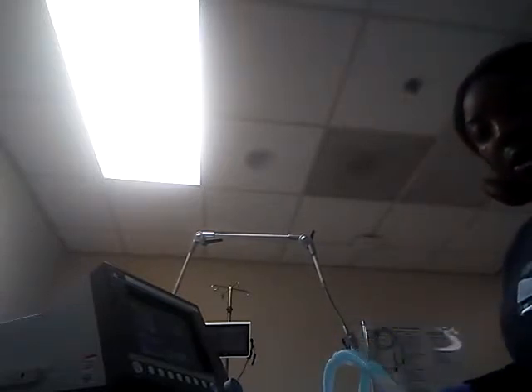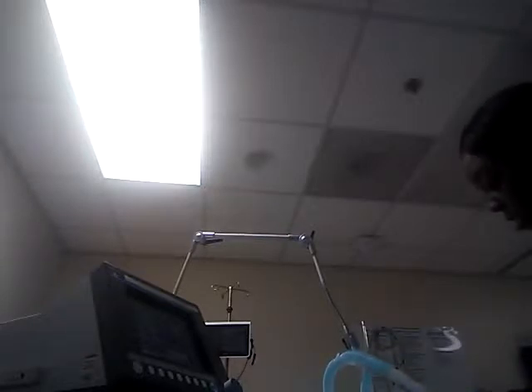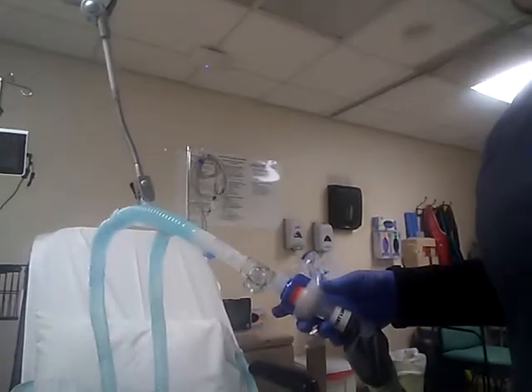Okay, when we turn our flow on the flow meter, we're going to actually turn our humidifier here to aerosol. If we don't turn to aerosol, the patient is not going to get their medication. See that? Aerosol.